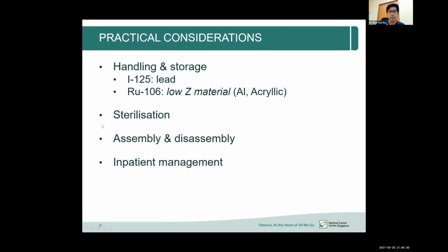And then, like I said, we actually had quite a few interesting patients. Usually we try to keep the patients outpatient so that we don't have to come up with a whole bunch of new protocols to manage inpatients. But we did have one patient who had very bad OSA, obstructive sleep apnea, and we had to keep her inpatient throughout while she had the plug in the eye. So once again we had to go to the ward, speak to the nurses, arrange a single room, and talk about nursing care for the patient while she was still radioactive.